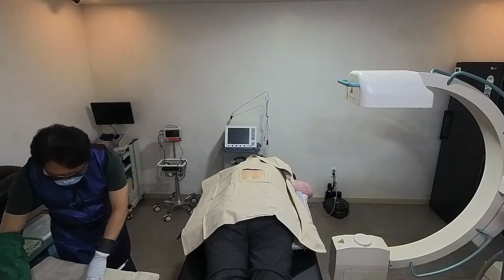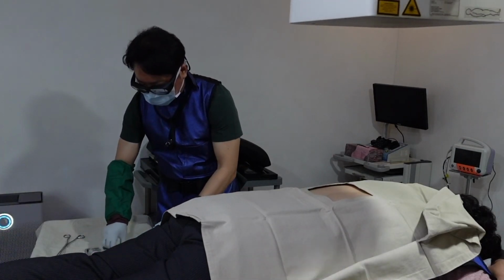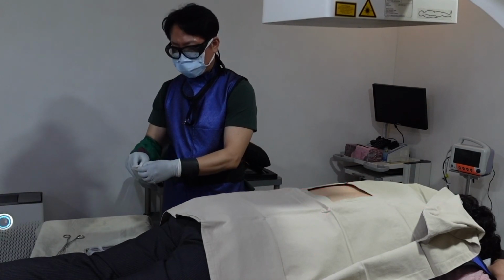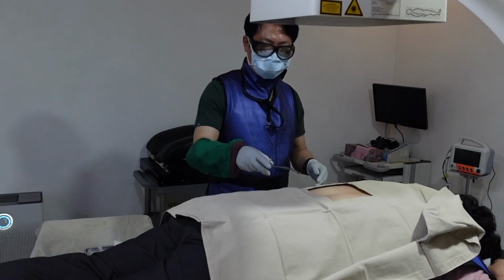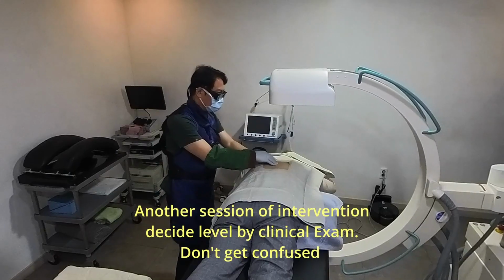First, there is anatomical complexity. The thoracic spine has a more complex anatomy than the lumbar and cervical regions, with ribs and their articulations, narrower intervertebral foramina, and a smaller spinal canal. These factors can make it difficult to target the desired foraminal space and nerve root accurately.